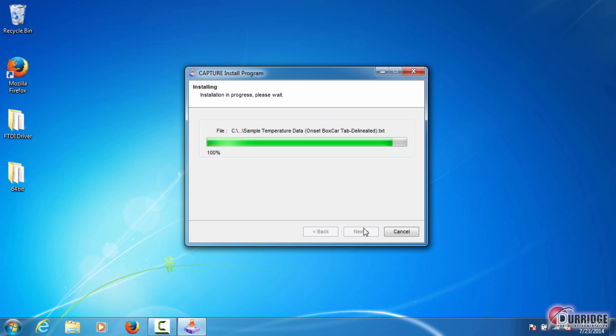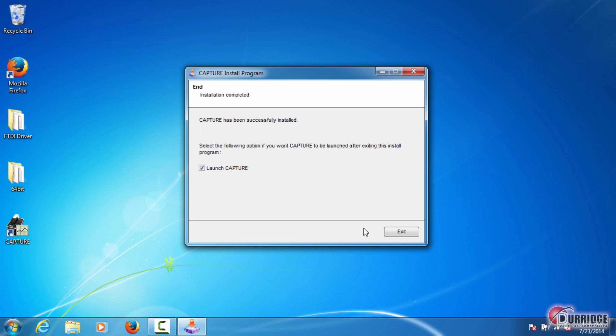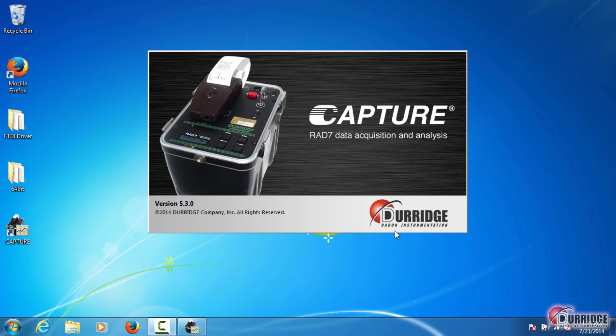When Capture is successfully installed, a shortcut to the program appears on the desktop. If the Launch Capture checkbox is selected and you click Exit, the program will automatically launch.